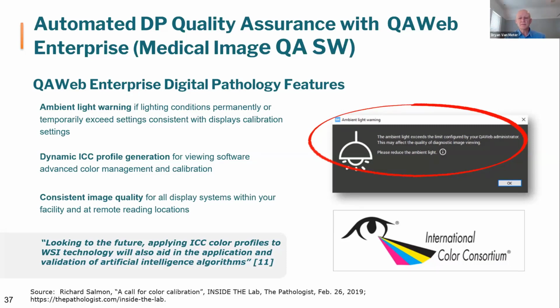So a whole slide imaging system can do the exact same thing. It says, hey, I see this color, this is how I represent this color. They create an ICC profile. Both of those ICC profiles are handed over to the image management system, which has a color management handshake between the two, so that what's being displayed on the screen is in harmony throughout the whole system that is managed in that pixel pipeline related to color.